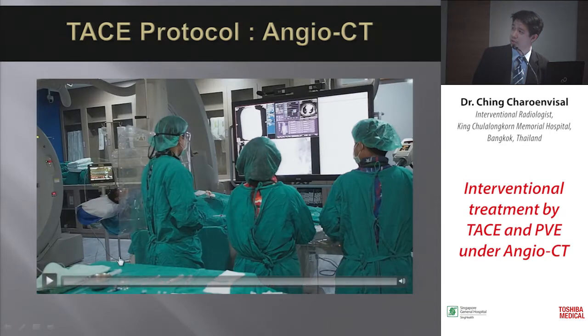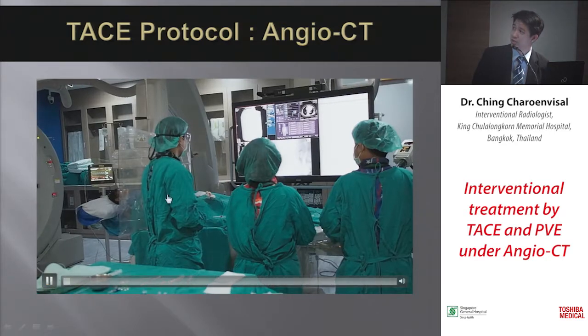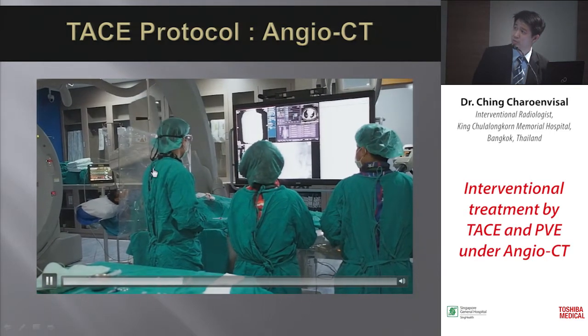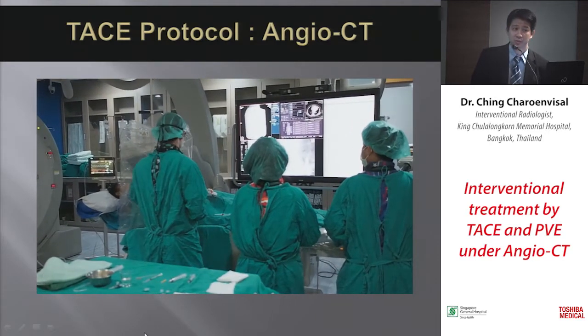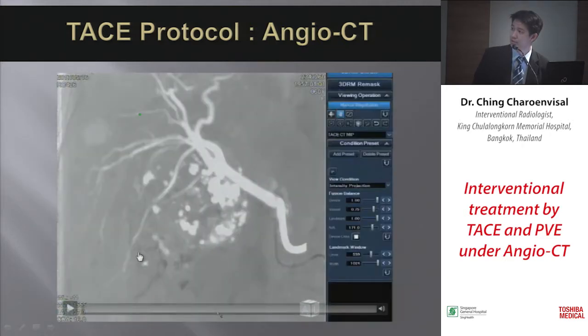And then we use the auto angle to move the fluoroscopy to the same angle automatically. And then we select the microcatheter into the feeding artery.